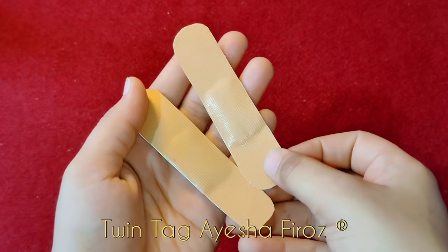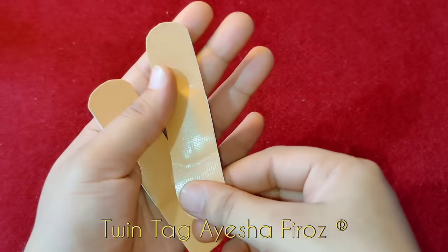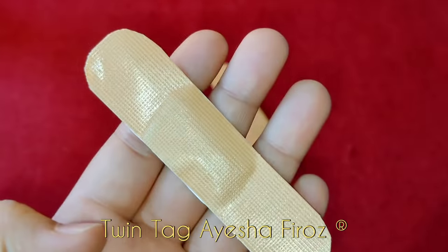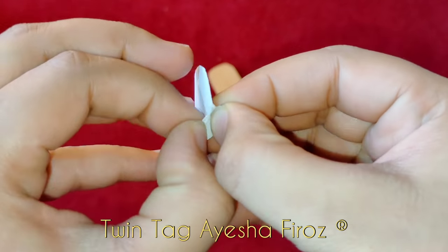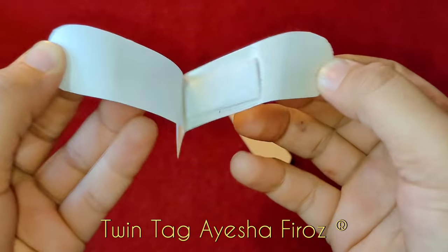Friends, it looks like a real bandage. You can peel it and apply it. Simply peel it and you can apply it.